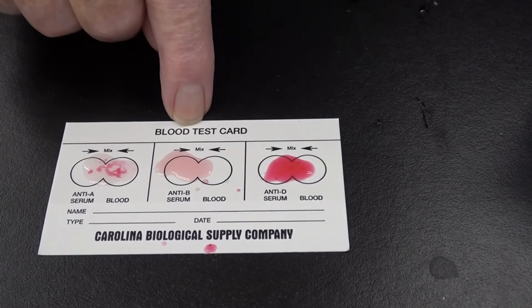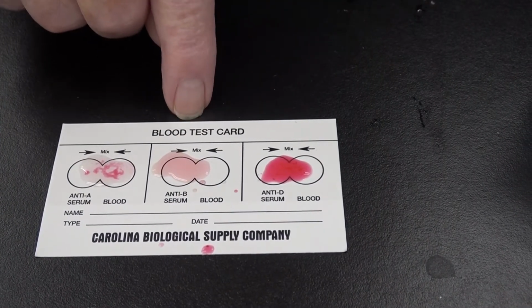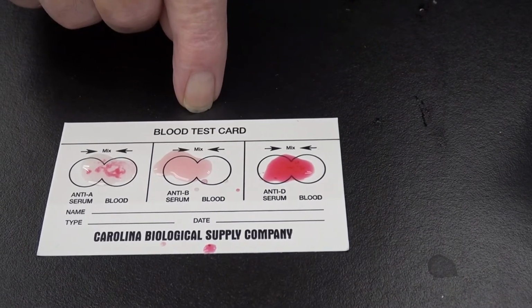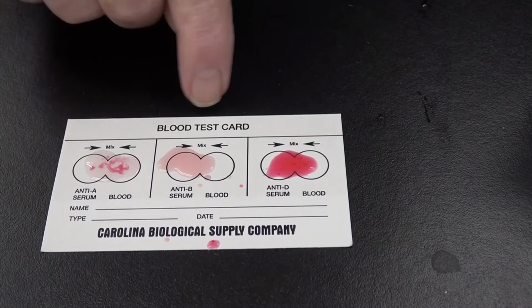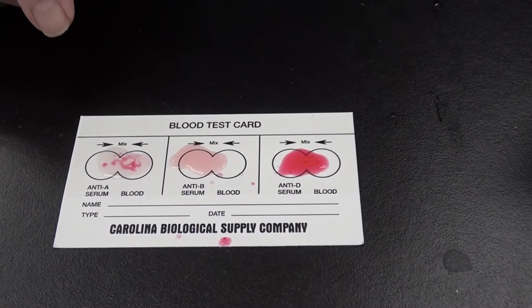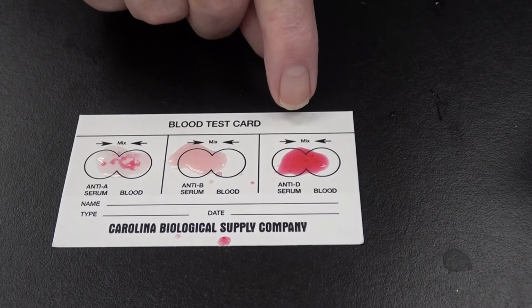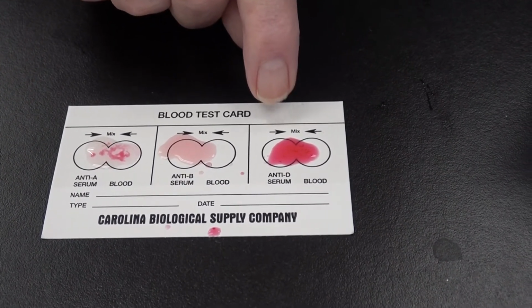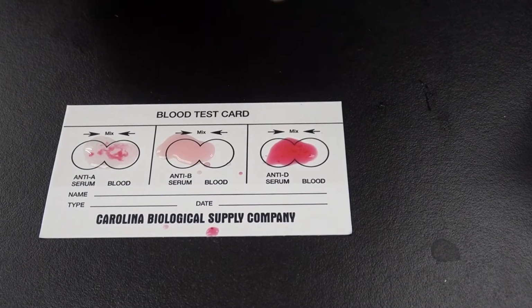If it had clumped on B, it would be anti-B serum, it would be B blood. If it had clumped on both, it'd be AB. If it clumped on neither of them, it would have been O. This would be the RH factor. So this is a negative, did not clump, so this would be RH negative.